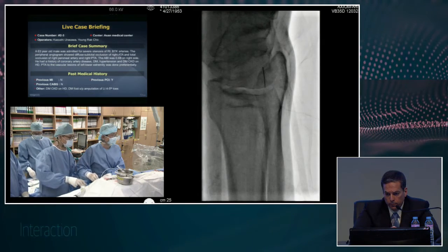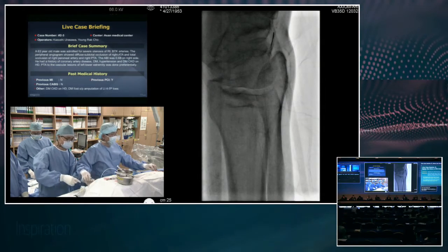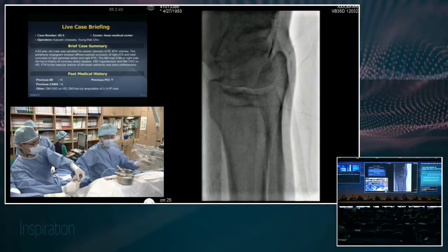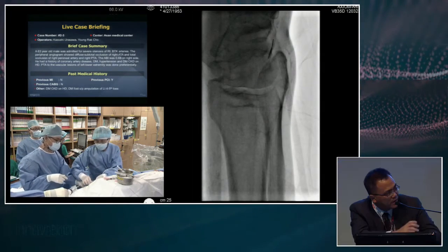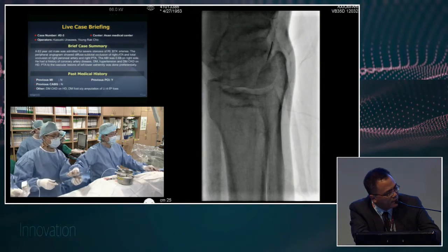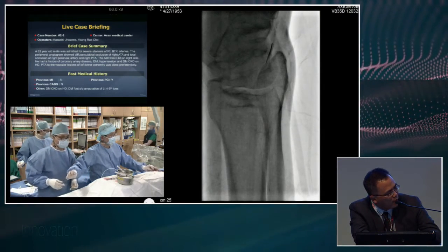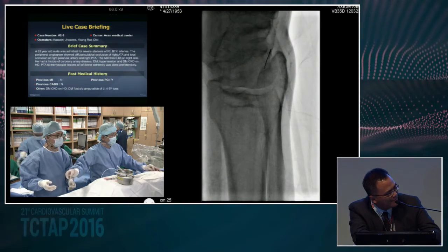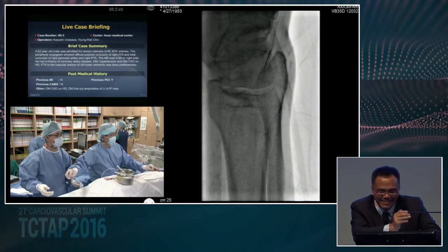Actually, for me, the last couple of months I've moved towards a more non-compliant balloon, about 120 length from Obersnitch, that really does a lot of high-pressure balloon dilatation to crack that calcium. And then because I don't want to hang around too long doing multiple balloon inflations, I top it off with a long balloon and go for tea or something like that after that.